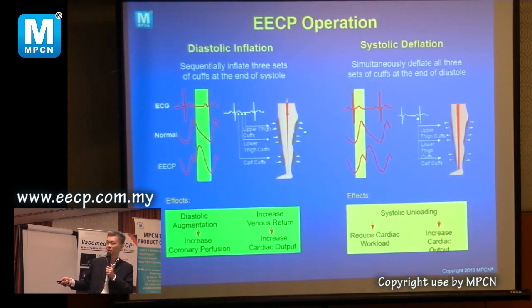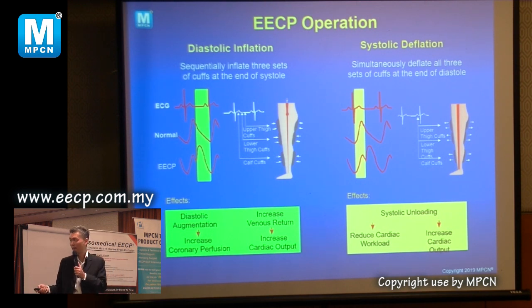Okay, so this is a contraction during diastole, when the heart relaxes. Relax, let go when it's contracting so that it doesn't fight. If not, when your heart is contracting in systole and this thing also contracts, they are fighting with each other, so it cannot work. So this one you all understand, right? It's a very simple logic.